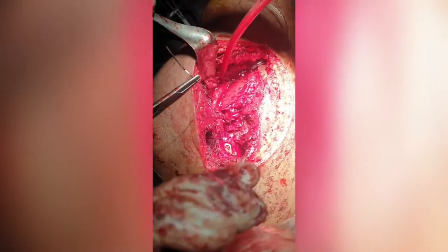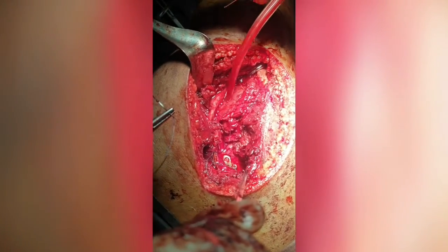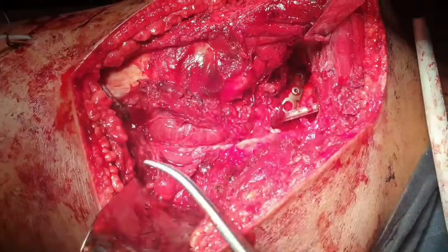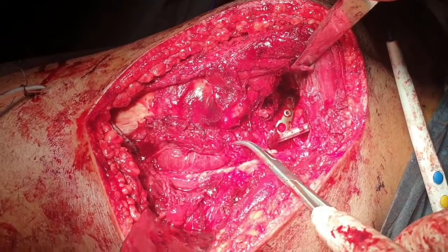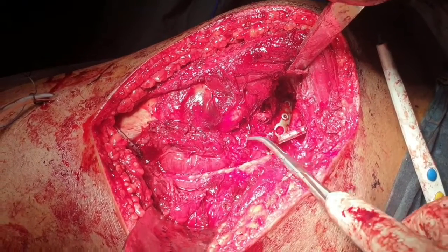So see, this is the sciatic nerve, and it lies just posterior to the quadratus femoris. So we have already repaired the short rotator. This is quadratus femoris, and here is the conjoint tendon of the two gemelli and obturator internus.